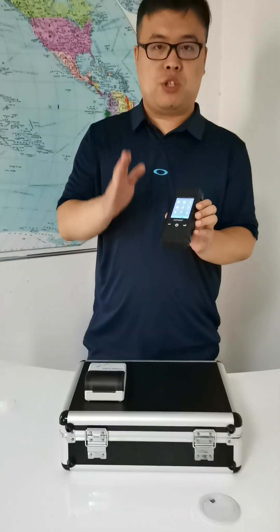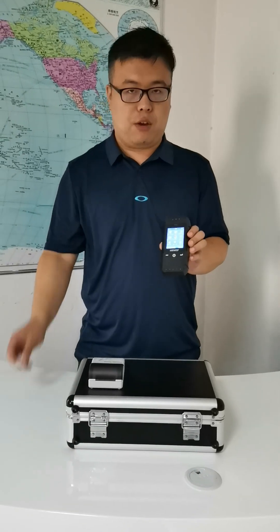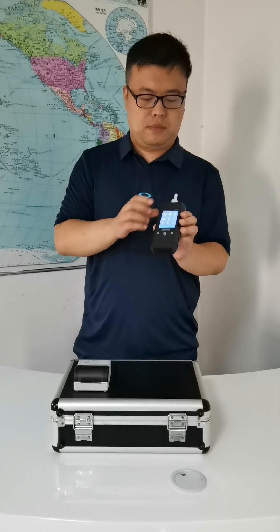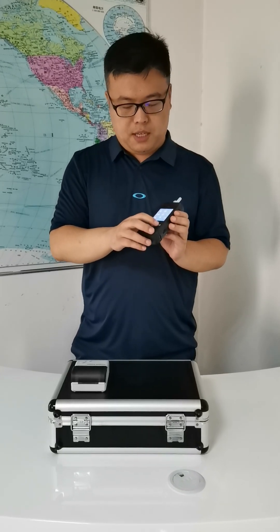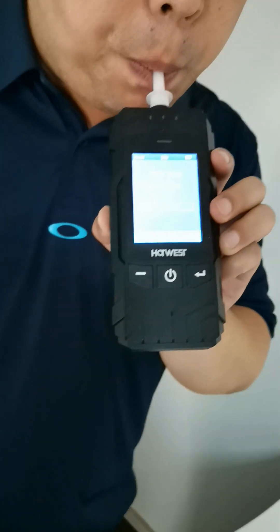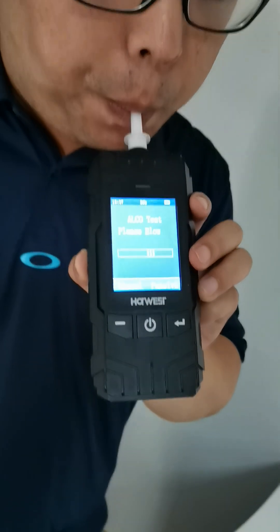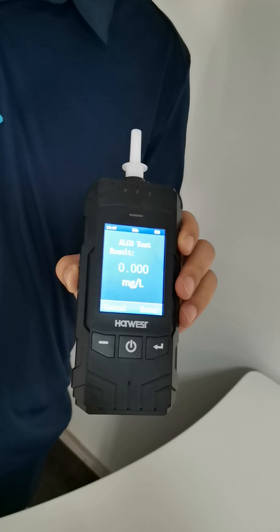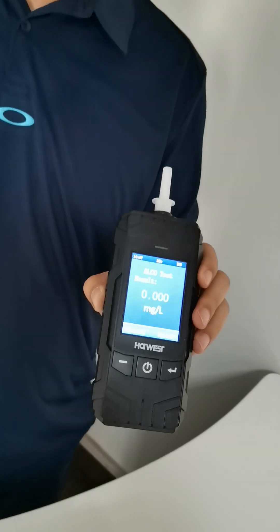Next I'm going to show how this one works for the accurate check. Normally for an accurate check I need to attach a mouthpiece. Attach mouthpiece, press test, I'll blow. So this is the reading result.